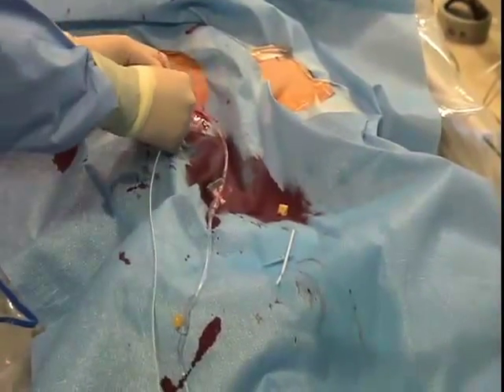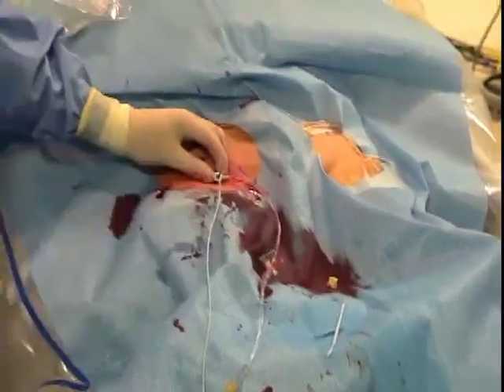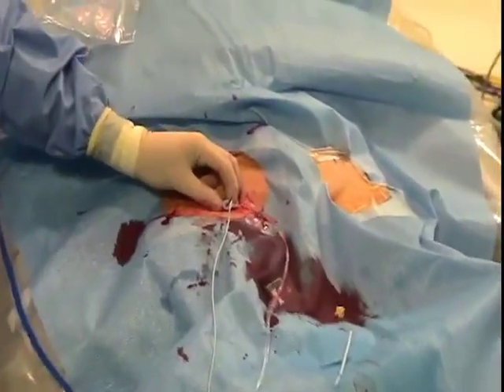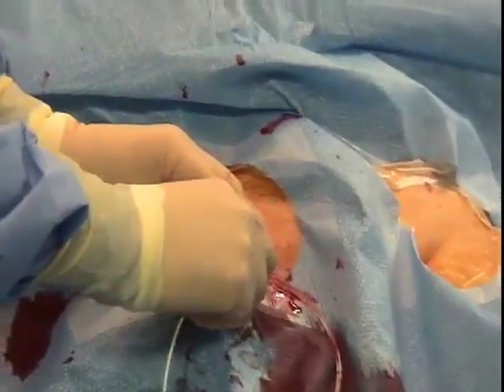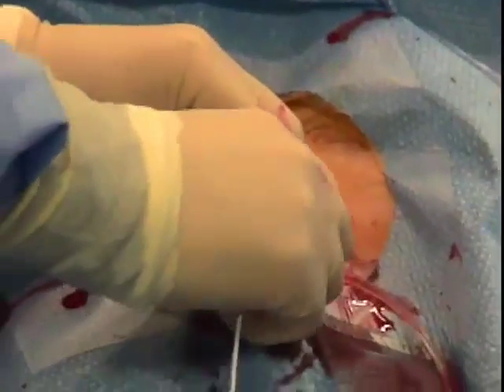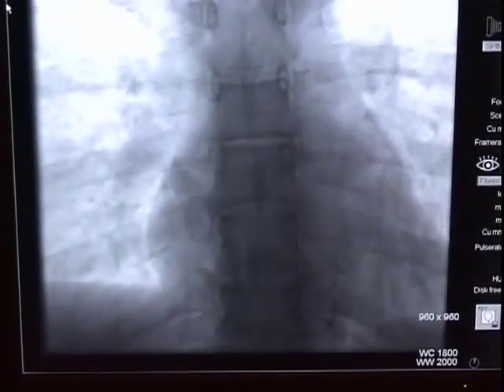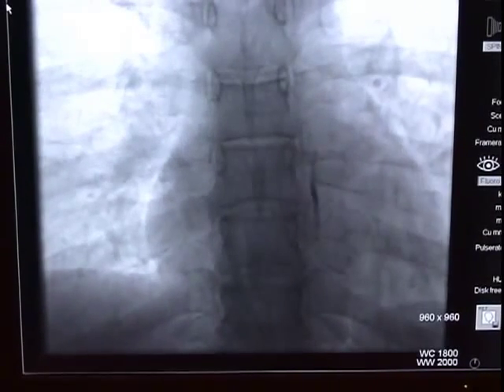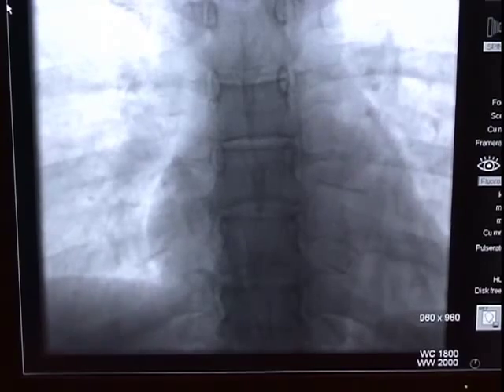The catheter tip is now inserted into a sheath, which sits in the right common femoral artery. All work is done through this sheath. The catheter is advanced, and we will now use x-rays to guide what we are doing. Here the catheter is being advanced in the aorta.